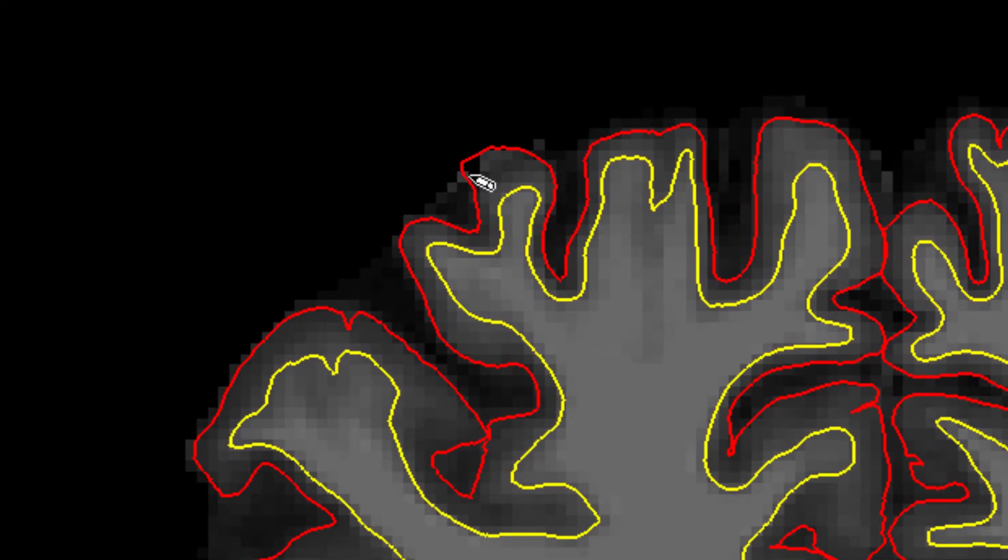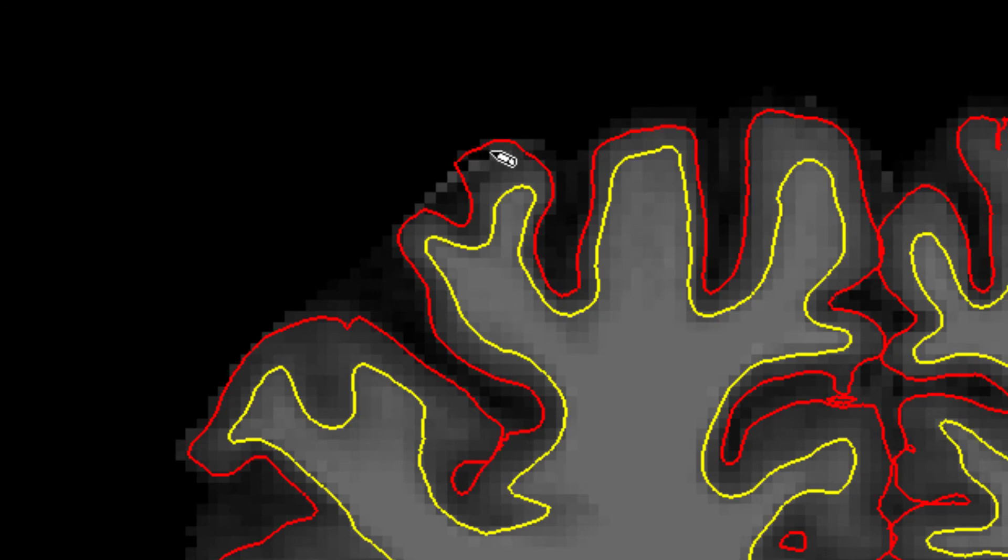Erase those voxels which seem to be part of the dura. Again, be conservative and take care not to erase cortex.